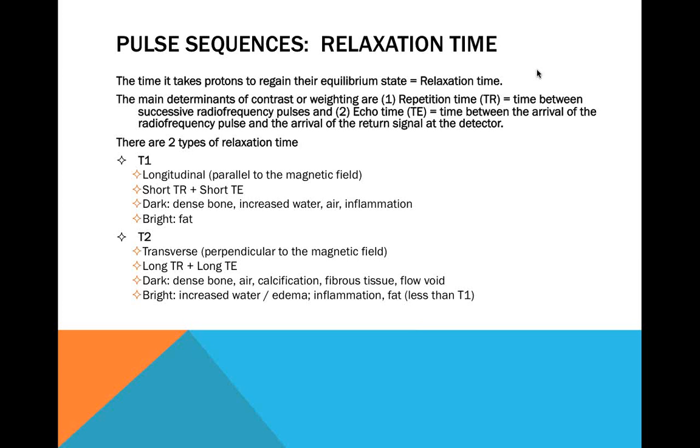So just talking about the slices within the MRI, just to review that. When people lie down for these imaging studies, the sequences are generated at certain intervals, usually around 3 millimeters. And you look at the images at every single slice, pretty much. It almost shows like you're scrolling through the entire body, so it's pretty fluid.